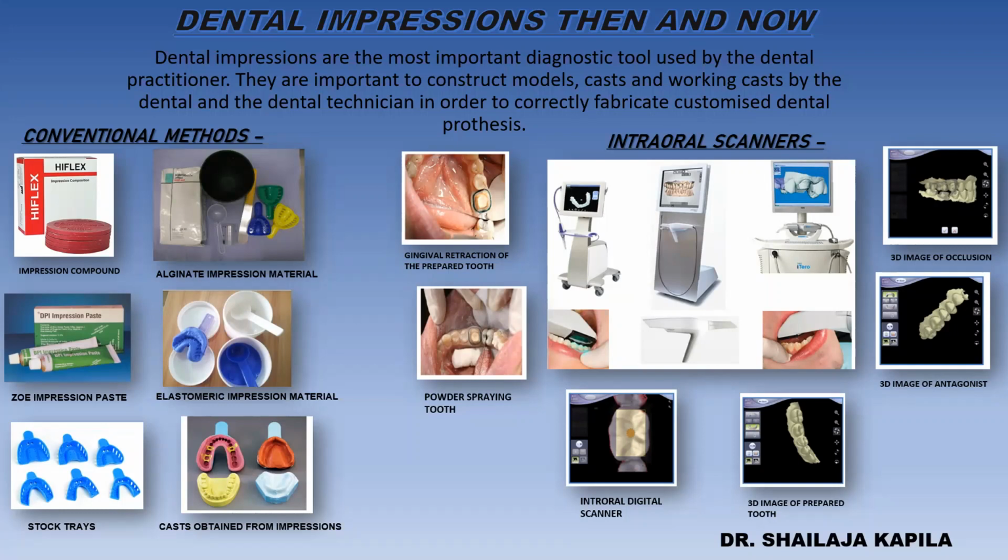The main intraoral digital impression systems currently available in the market include CEREC, Lava COS, iTero, E4D, and Trios. They vary from each other in terms of key features such as working principle, light source, the necessity of powder coat spraying, operative process, and output file format. We shall now have a look at the operational process of the intraoral digital impression devices.